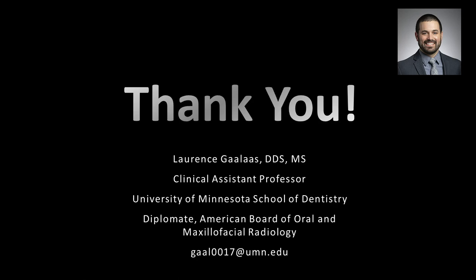The best thing you can do, of course, is try to get them to relax their shoulders as much as they can. On many machines, you can raise the field of view up just a little bit and you'll still get what you need. Many other times, if you can tilt the patient's chin up, that will raise that field of view away from their shoulders.